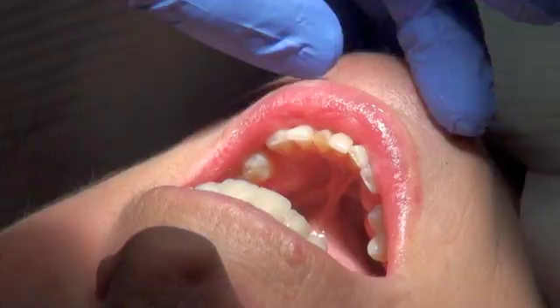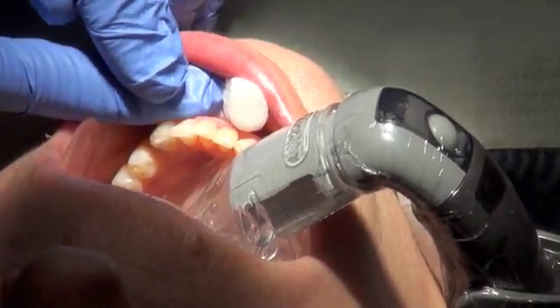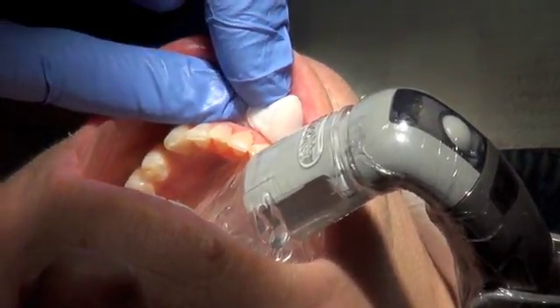The patient almost fell over when we told her that we could replace her porcelain veneer that day. After numbing the tooth, we created a rough draft of the shape and contour of her soon-to-be veneer by hand bonding materials that would mimic the tooth structure.